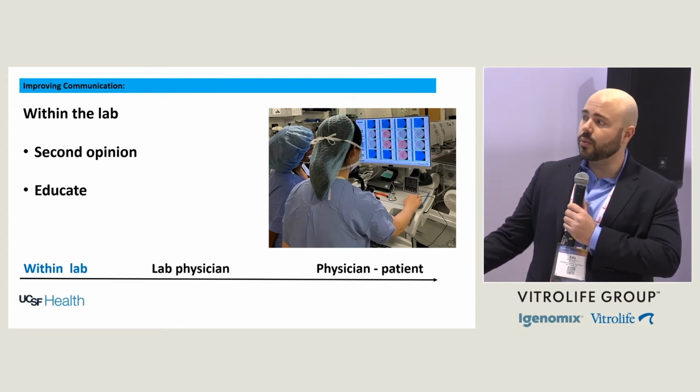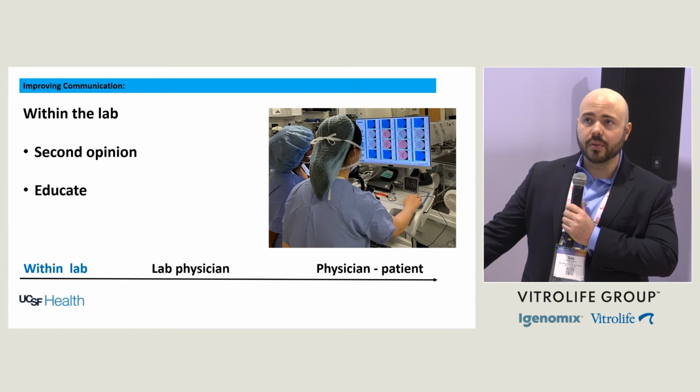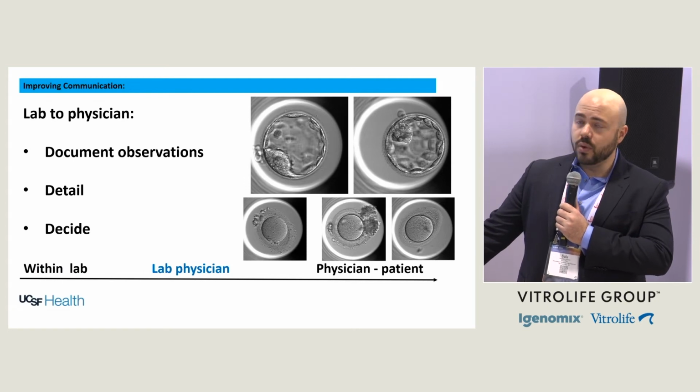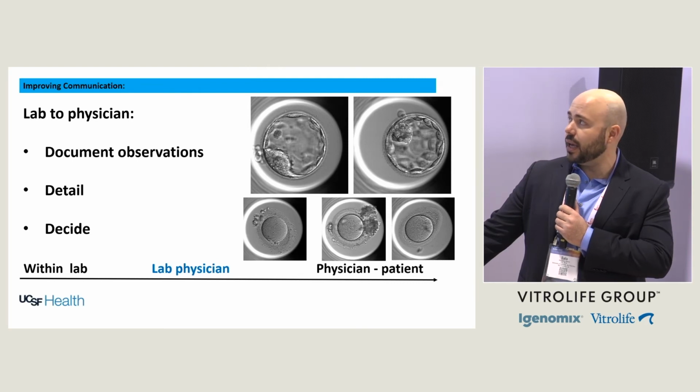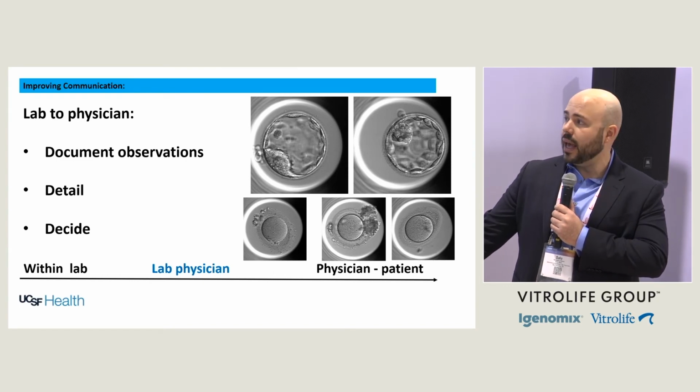You can educate. We at UCSF have fellowship and residency programs. So we do have a lot of personnel or students rotating through the lab to learn more about what we do in the lab. So we do a lot of education with those images. So now, when we want to give a message to a doctor about a patient or about a case, and we want to write, what does this embryo look like? Well, now we can send an image directly from our EMR to the doctor in a more efficient way, because we can give a video of how this embryo is being formed, and we can make a decision.